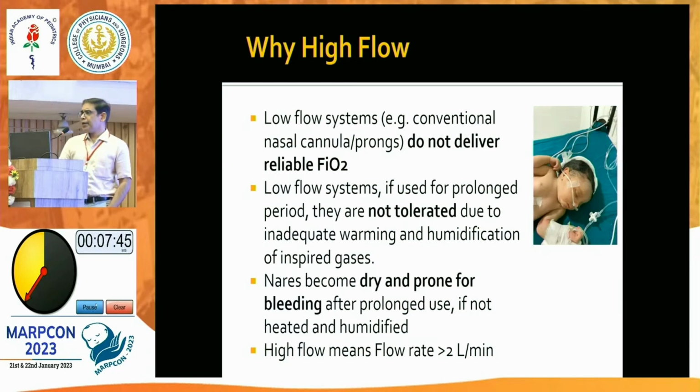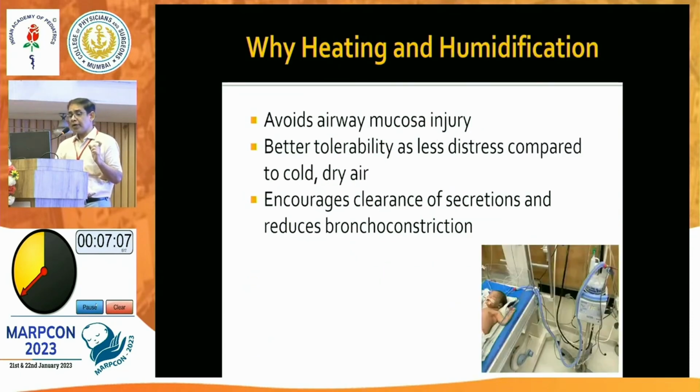Why high flow and why not low flow like the nasal prongs, like in this baby, how we use it? That low flow is not heated and humidified, and we would be giving very dry oxygen and gases to the baby, and this won't be tolerated well. The nares will become dry and they are prone to bleeding. So in our initial usages, when we started using that bottled CPAP without humidification, a lot of babies used to have trauma and obstructive apnea because of the crust formation and bleeding, and many times babies used to go on the ventilator because it was not properly humidified.